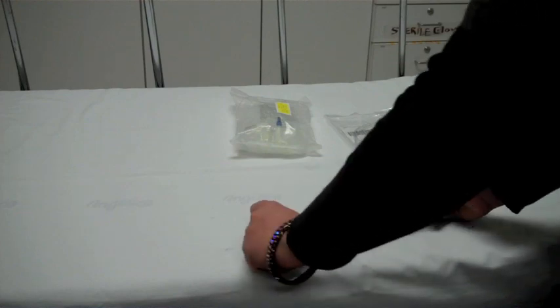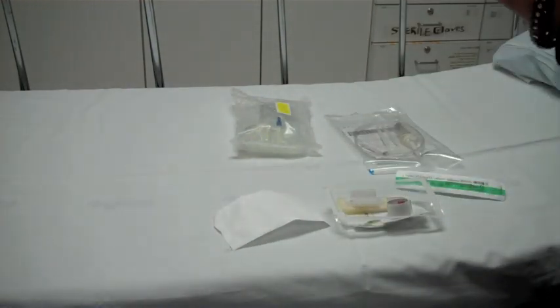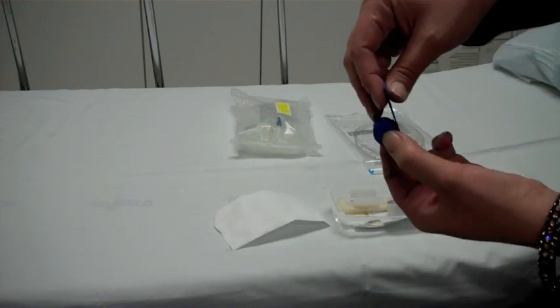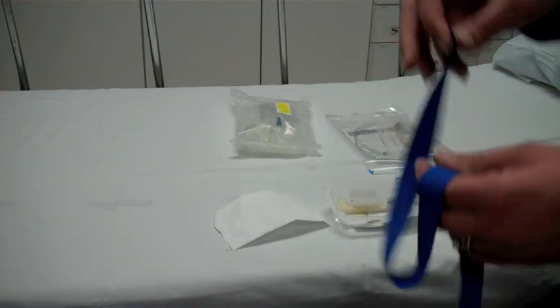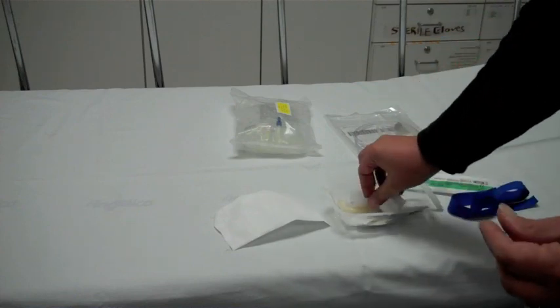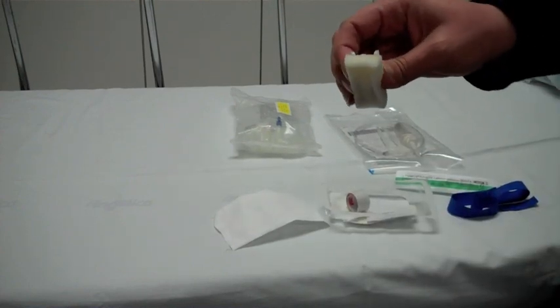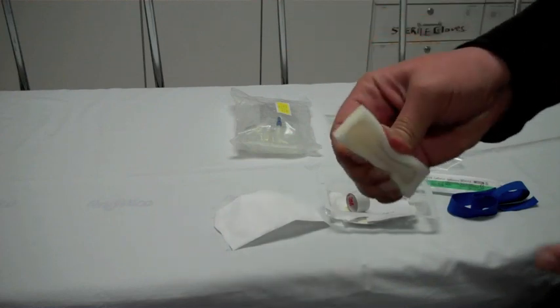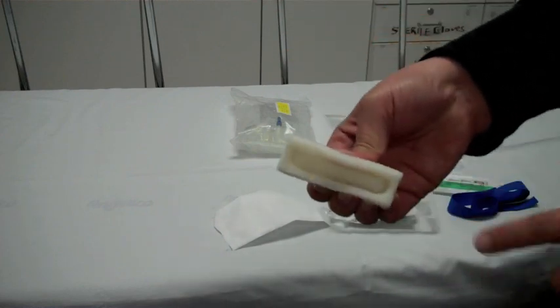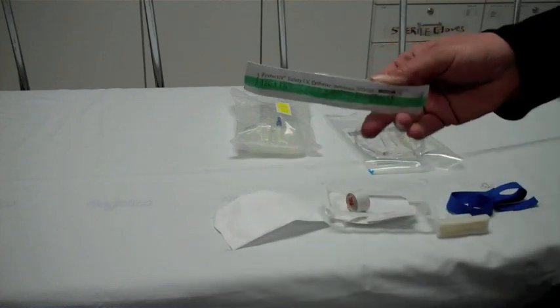This is part of the IV setup. This will be your tourniquet. Your cleansing cloth — break it here, squeeze, and then it comes wet here. And then you're ready to start your IV.